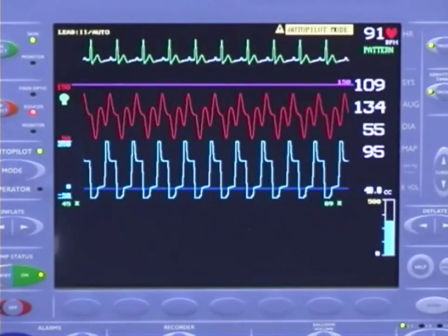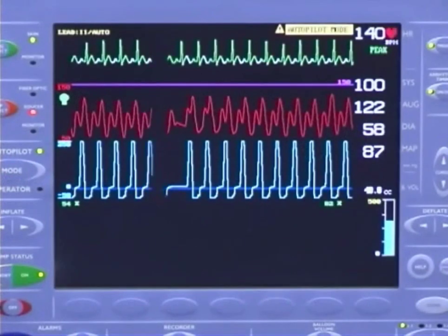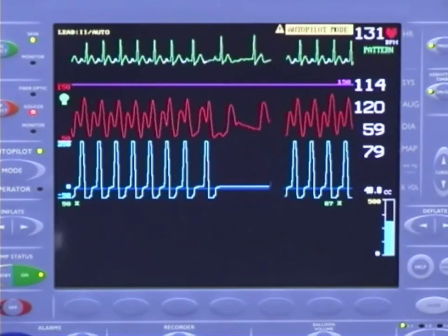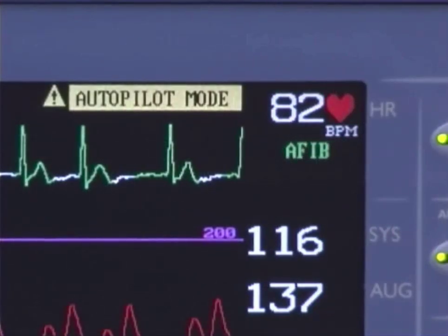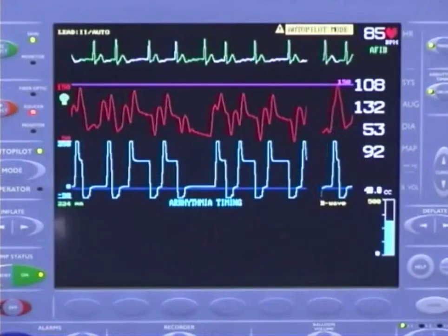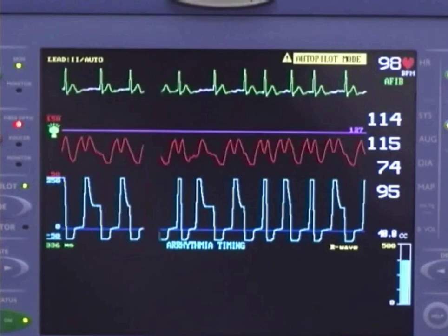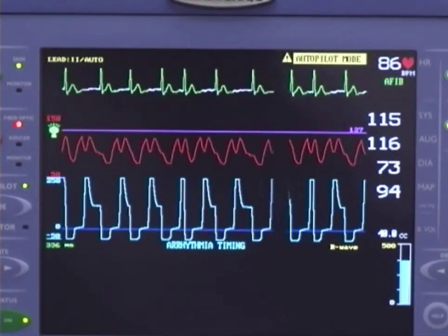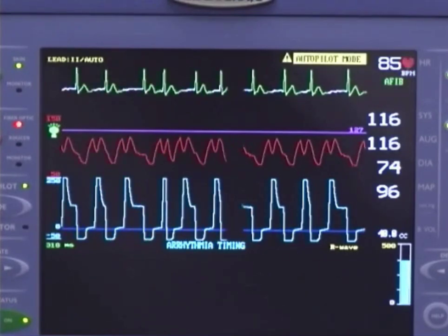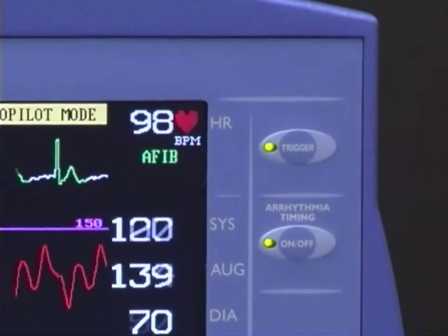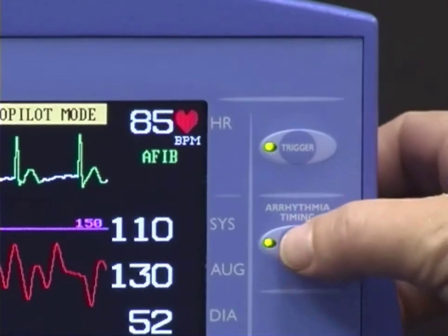AutoPilot will automatically select the trigger mode based on the signals available and the patient's condition. If the patient is experiencing an irregular rhythm such as atrial fibrillation and an ECG is available to the pump, AFib trigger will automatically be selected. This trigger utilizes R-wave deflation. The WAVE inflation, combined with R-wave deflation, makes the AutoCAT-2 Wave the first pump to have real-time, beat-to-beat timing on inflation and deflation. In the event that R-wave deflation is not desired, you can override this function by selecting Arrhythmia Timing Off.